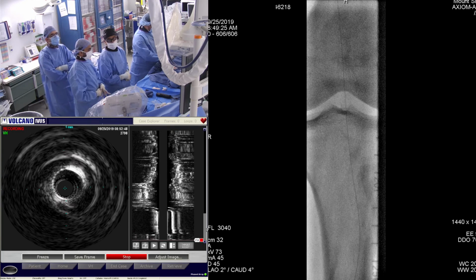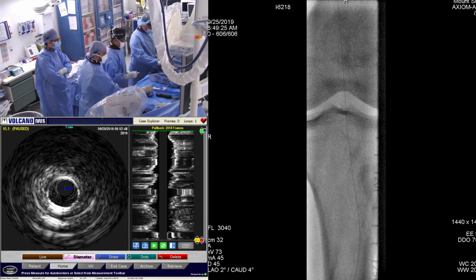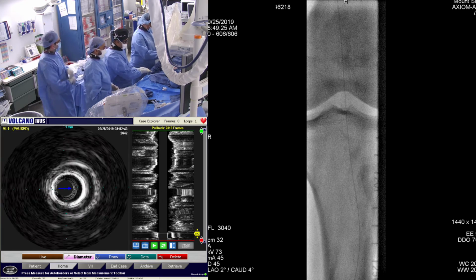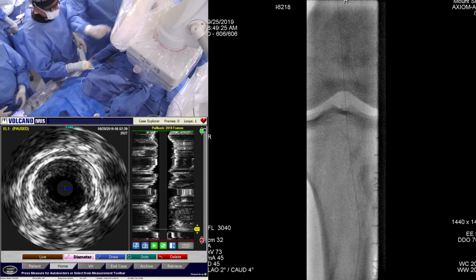And I think I'm just going to run an atherectomy device through. Give me an EXL, guys. I'm going to undersize my atherectomy device just to open it up a little bit, probably not take it into the posterior tibial, just do my popliteal, and then go ahead and possibly DCB balloon it.